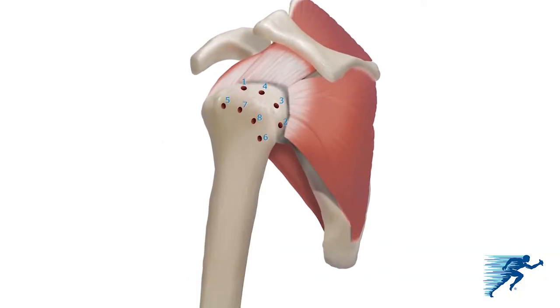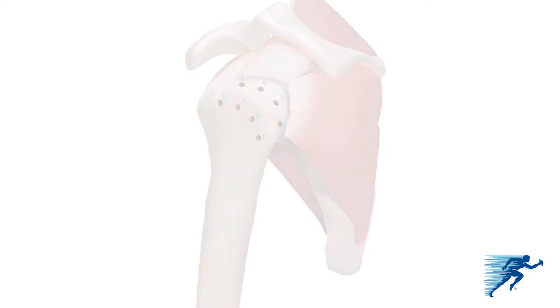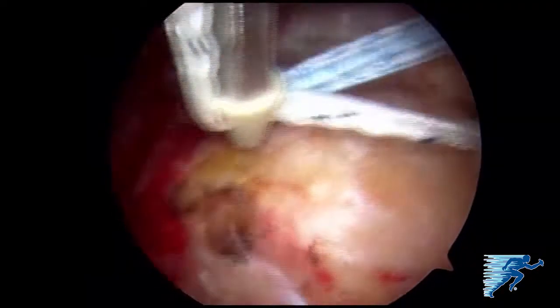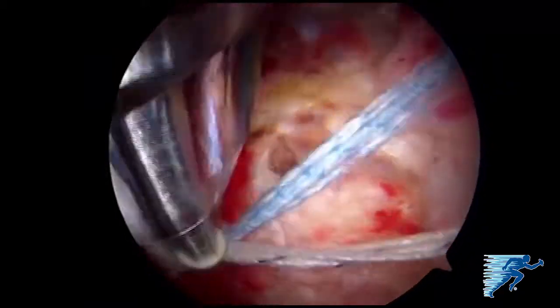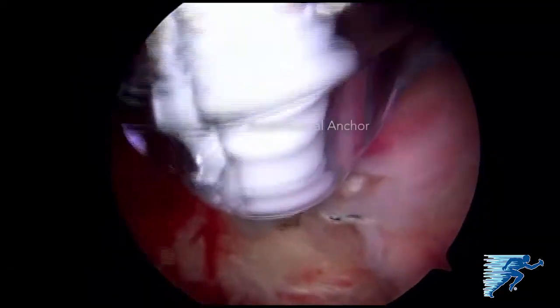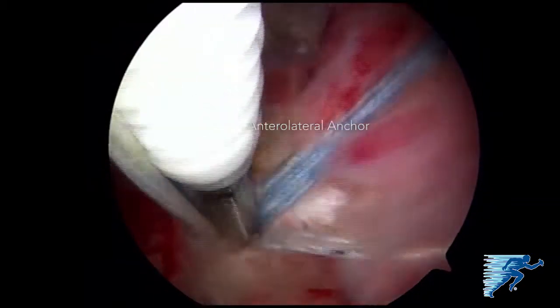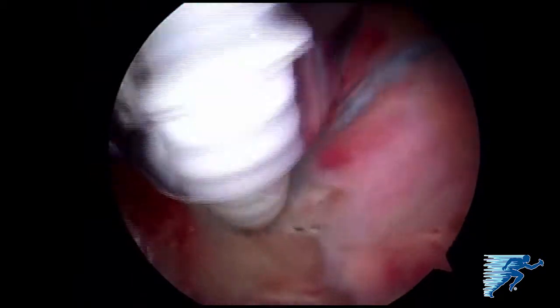The lateral row consists of four additional 4.75 millimeter biocomposite swivel lock anchors. By tensioning the fiber tapes through the eyelet of the swivel lock anchor, the rotator cuff is compressed back down onto the footprint using an extended length speed bridge repair technique. This is repeated for each of the four lateral anchors.